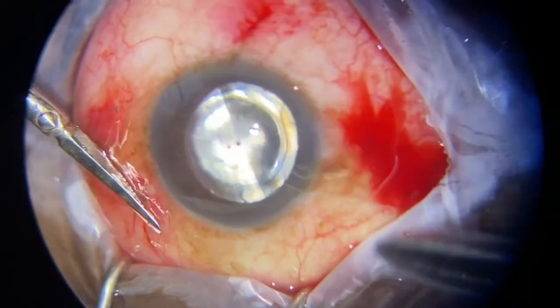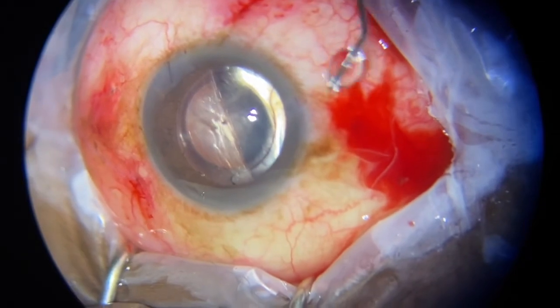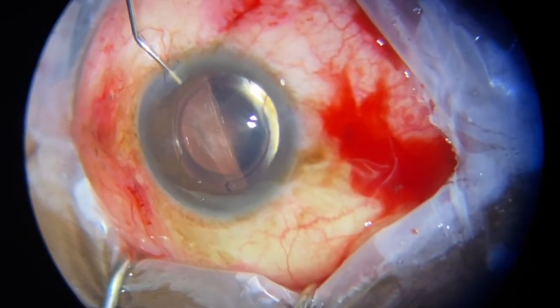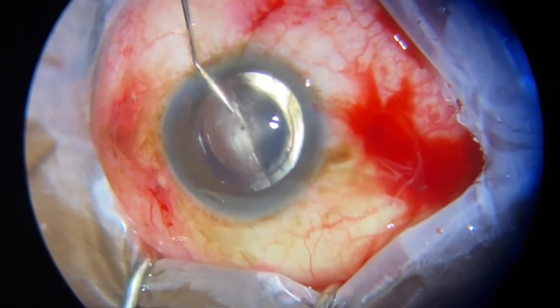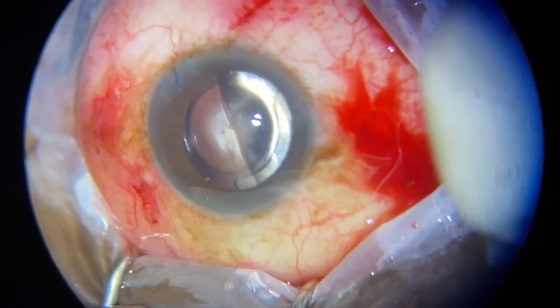At this point I flush out all the viscoelastic in the anterior chamber and then get the correct consistency of the eye. I inject dexamethasone and gentamicin at the end of the procedure and then I close.